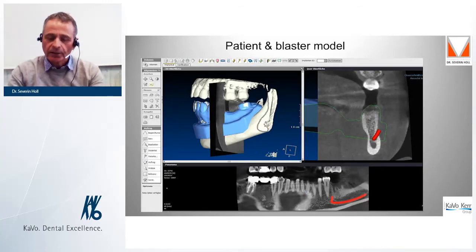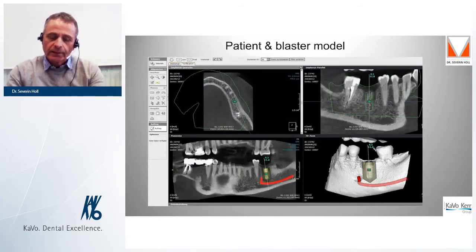Here is the result. Top left, we see the white X-ray. This CBCT is overlaid by our blue plaster model. The indicated cross-section is shown on the top right. The green line is again our plaster model and represents the gingival situation of the patient. Below you can see the panoramic image with the nervus alveolaris inferior. With this basis, we can perform an accurate implant planning in all levels, taking the bone into account and the security area around the implant.